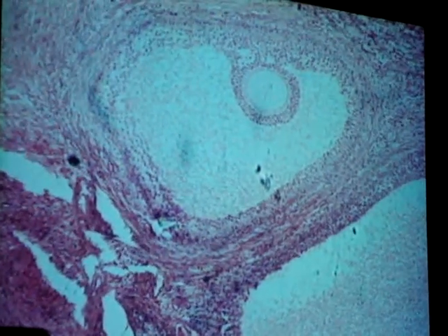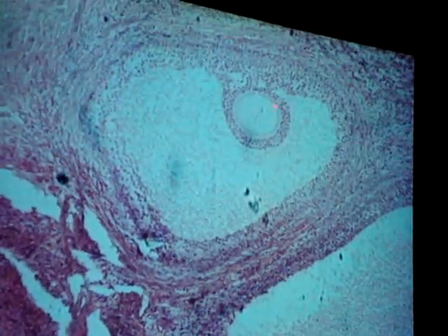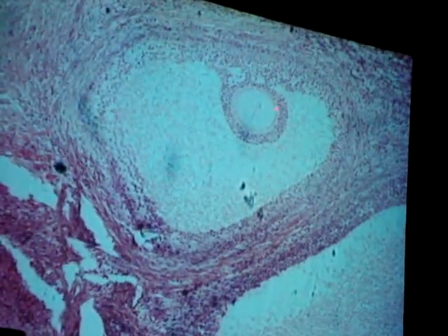And then everything else has to do with what's around the egg. So this here in the middle, this whole thing right here is the egg, the oocyte. All of that's the oocyte. Now immediately surrounding the outside of that egg, that oocyte right here, is a non-cellular layer, and it's called the zona pellucida. Non-cellular layer, zona pellucida. Surrounding that is a layer of cells, and that's called the corona radiata.